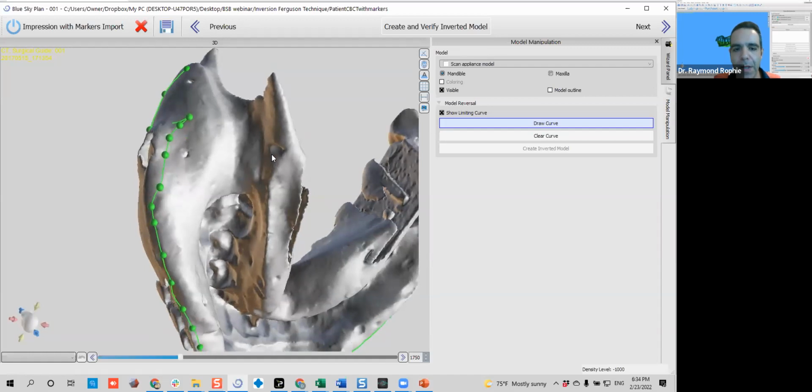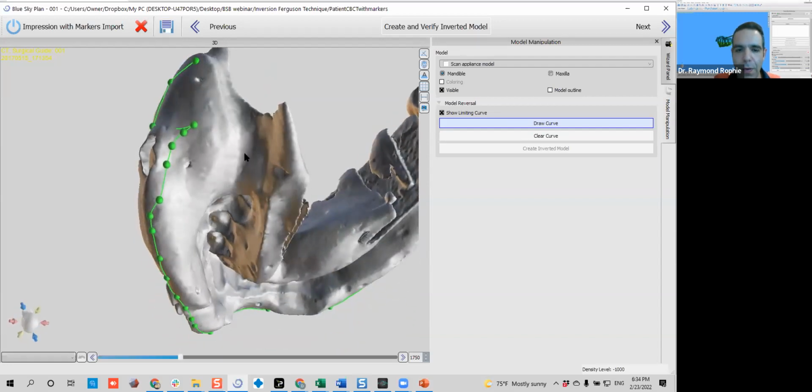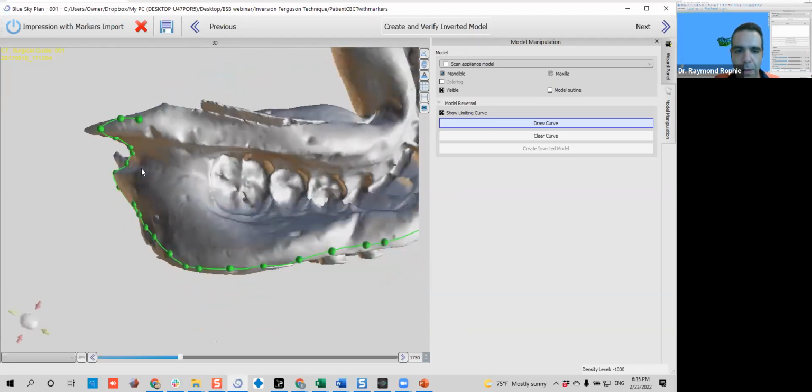So be careful when you are scanning or acquiring your data, that on the area where you will place your implant, you really want to have the best quality of your scan. It's like when you're taking your impression, you take 2 steps. This is the area where you need to focus the most of the scan. So here is where you are taking the most care.